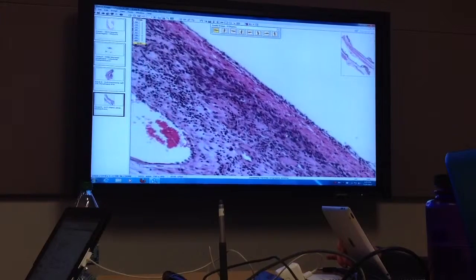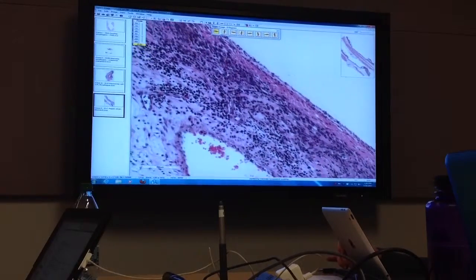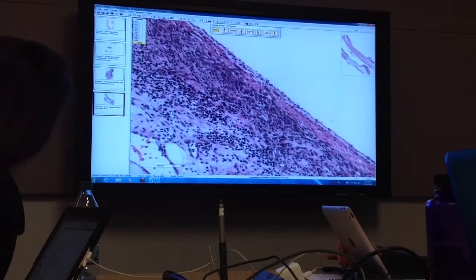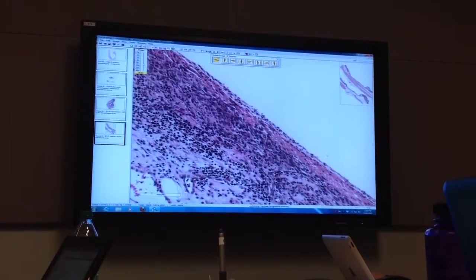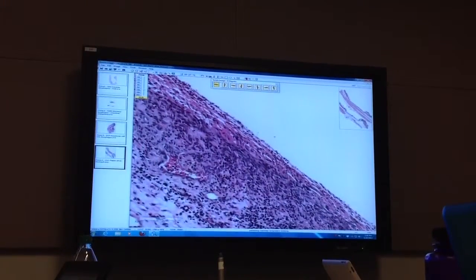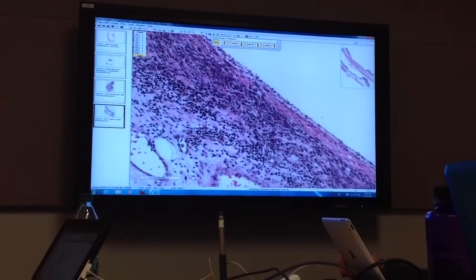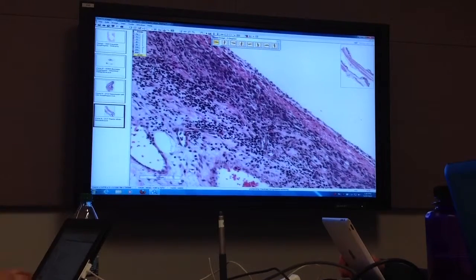So, what kind of cells are these? Acute, chronic? Here we've got some little black marbles, very round. So those probably are lymphocytes. Here's a bunch of cells that have eccentric nuclei and a lot of cytoplasm. So those are plasma cells. So this part here is chronic. And then the other thing is, I think it's hard to appreciate because there's so much inflammation. But do you see all these little red blood cells here? These little red things? These are little capillaries.